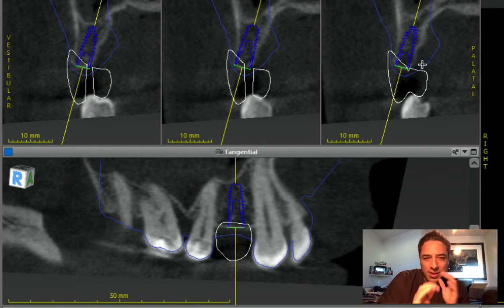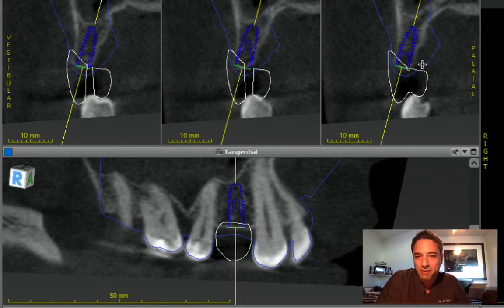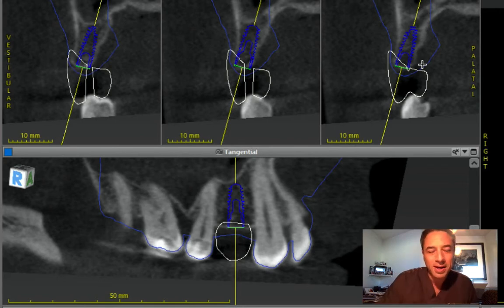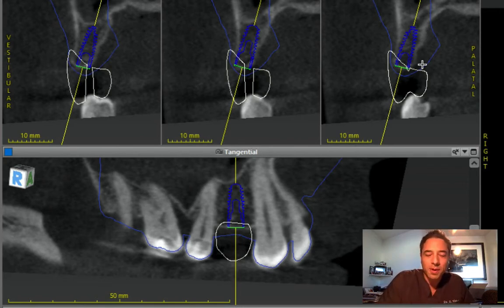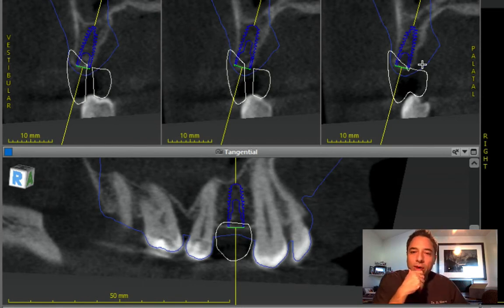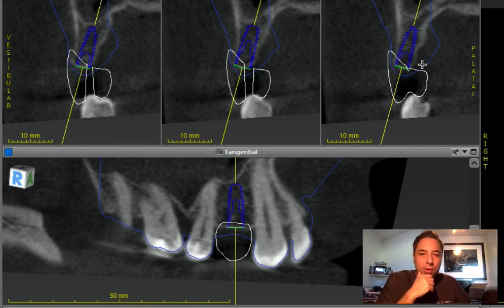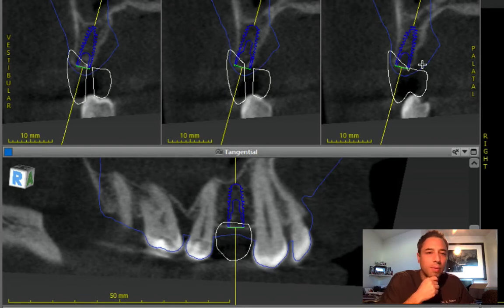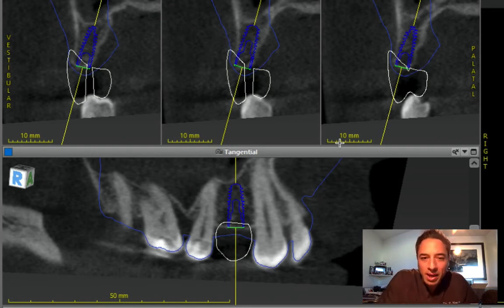So I think considering this site, if the patient is not up for augmentation — which is probably not necessary — I would certainly go with this position. You can probably tilt it another three to five degrees to the palate without compromising the buccal plate.